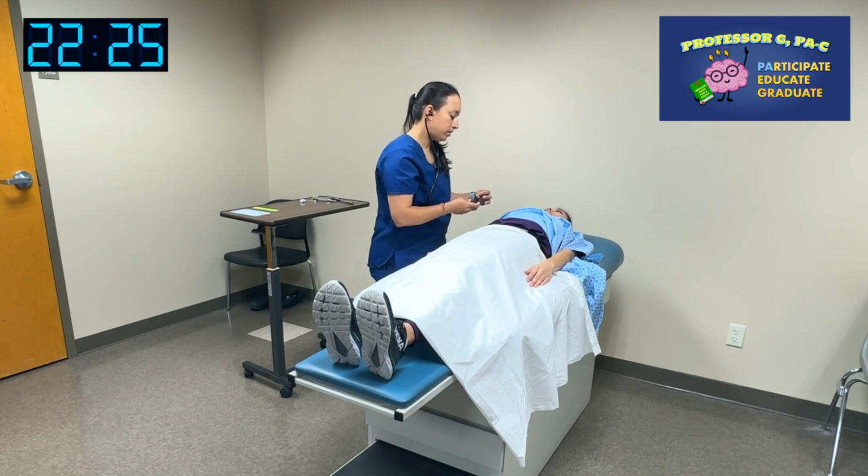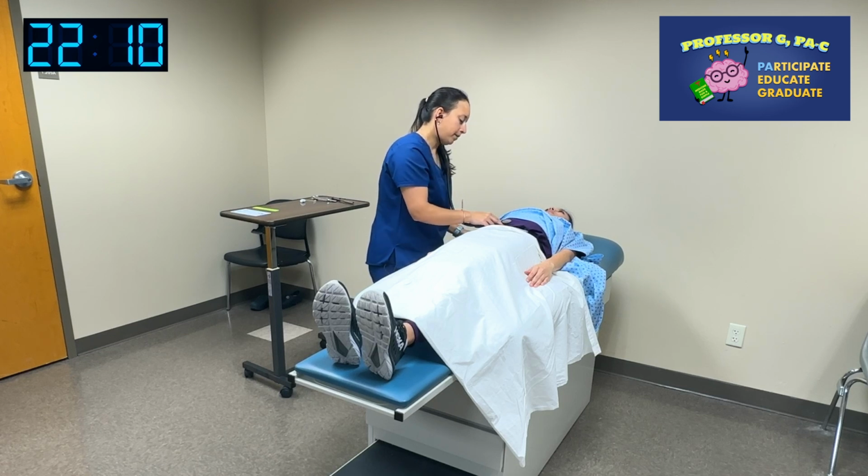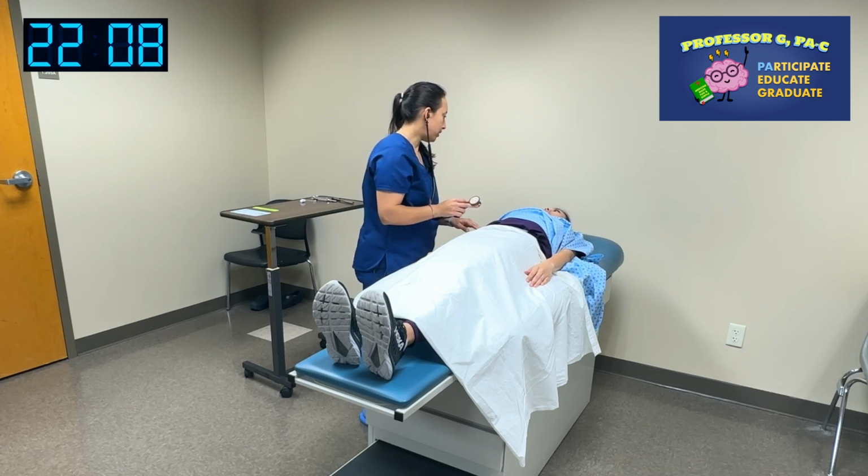Okay, and now I'm going to listen to a couple other spots. So I'm going to listen to your abdominal aorta, your renal arteries, and then I'm going to listen to your pulse down in the groin area. Is that all right with you?